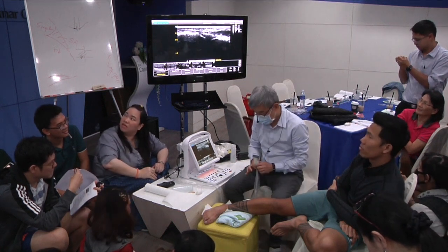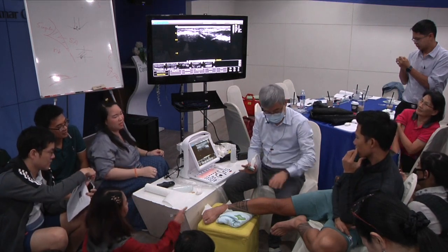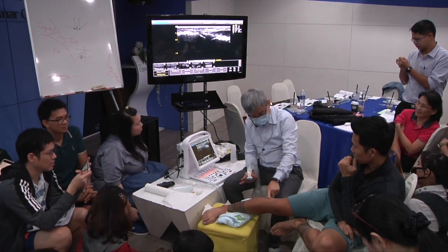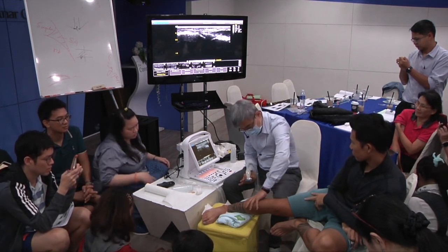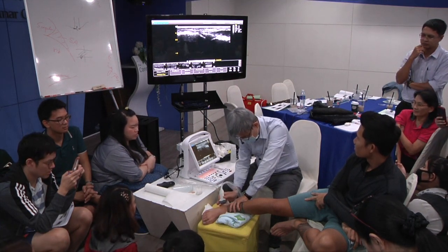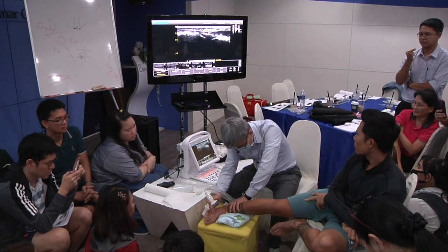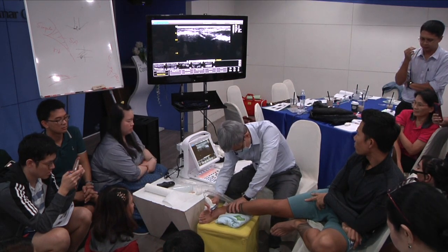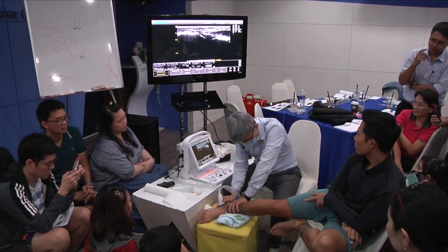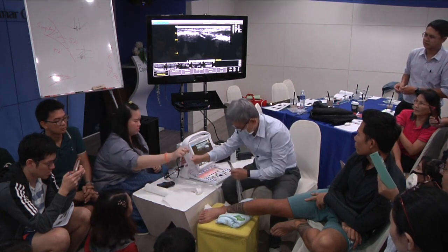Okay. CF, calcaneal fibular ligament. Okay. In this position, side lying. This is the fibula. Very good tattoo. Fibula. Okay. Slightly dorsiflexed, right? Slightly plantarflexed. Yeah. Straight. Slightly. Yeah, thank you.